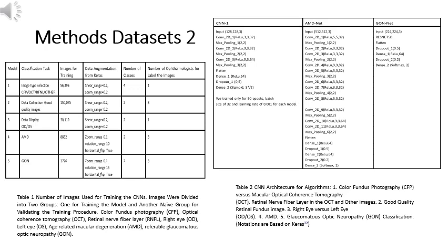The fourth model classifies the AMD CFP versus the normal CFP. Finally, the fifth model allows for the classification of normal CFP versus GON. Table 2 presents the 3 main CNN architectures. We have also published sample code for these architectures on https://github.com/octavif/optretina-cnns.